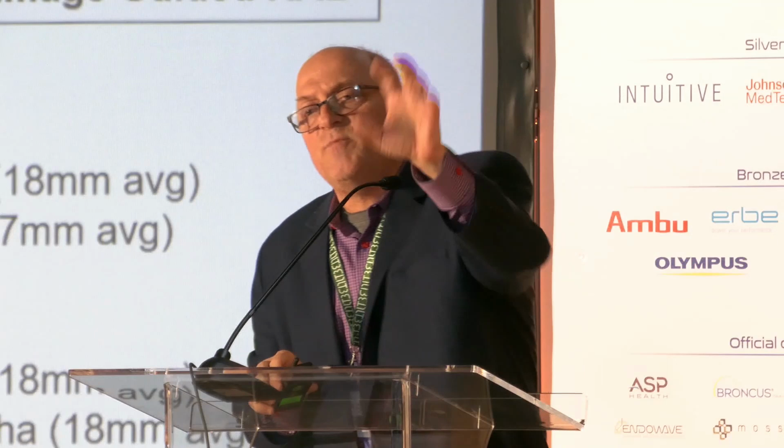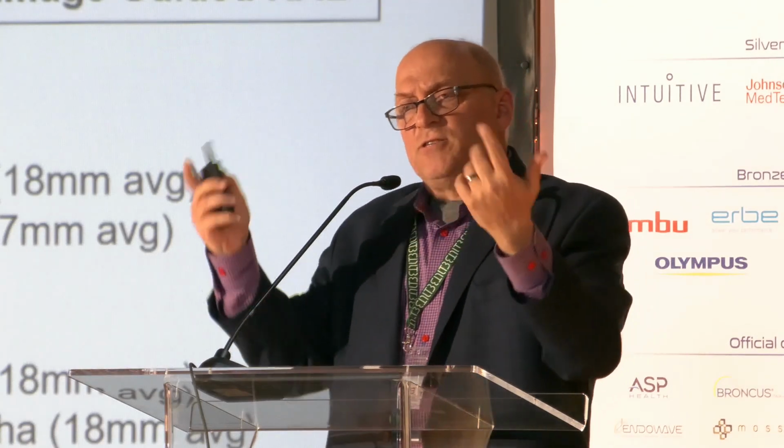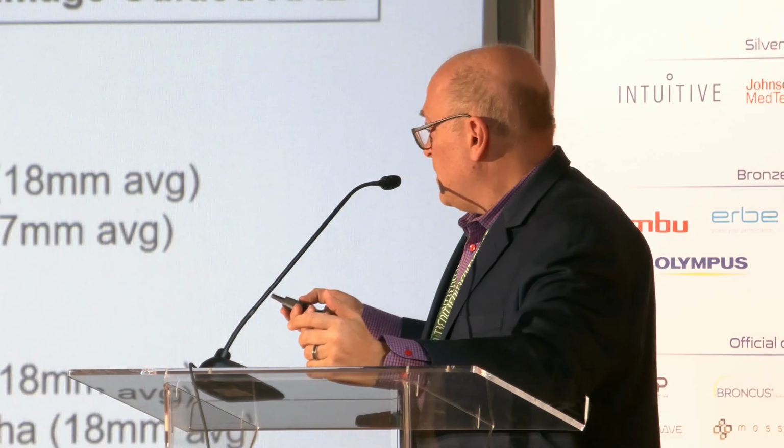And it's not just with the Galaxy. If you had an ION and added imaging to the ION, which people are doing, several presenters already said that. They use ION with their cone beam imaging. I like to use my ION with Body Vision, because the Cios integration doesn't have augmented fluoro. Body Vision does. I prefer that because it's faster. I think it's cleaner, but that's just my opinion.